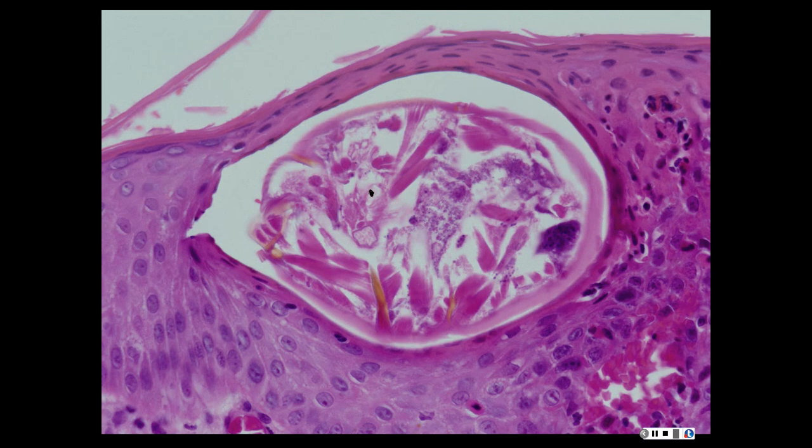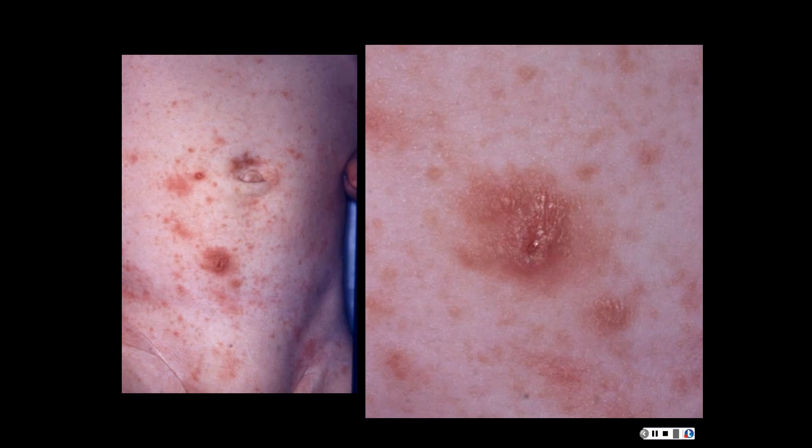And he was reviewing every slide to make sure it had pathology, and the mites showed up in the deeper sections, which meant a phone call to the university to tell them their patient had scabies. Can you guys take clinical photos for us? Yeah. You can see excoriations. If you think scabies, you can now see, of course, that's scabies in a kid, right? But remember, scabies can massively recruit CD30 cells, can massively recruit Langerhans cells, so can tick bites and things like that.